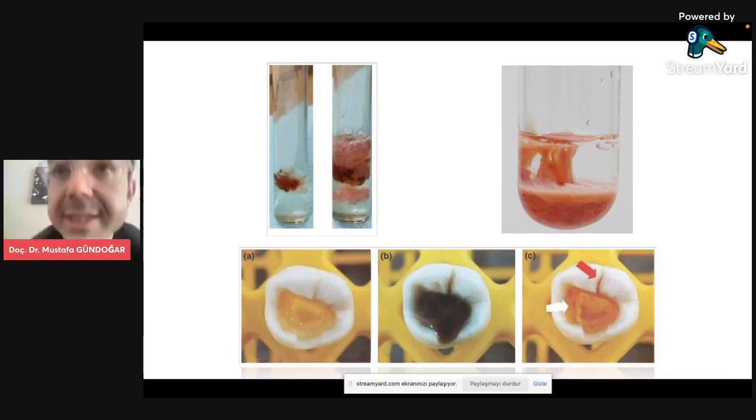you always have to neutralize the root canals by using distilled water, not only a small amount of 2 milliliters of distilled water. You have to use at least 8 or 10 milliliters of distilled water for neutralizing your root canals.